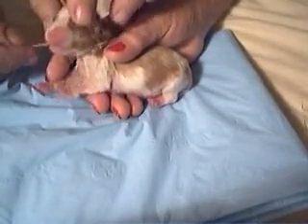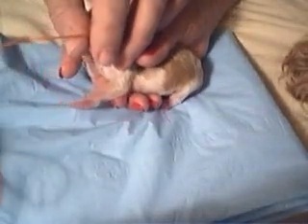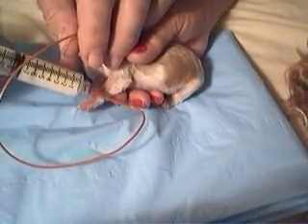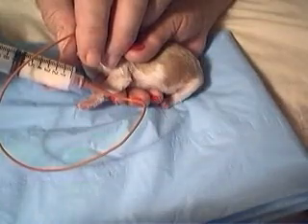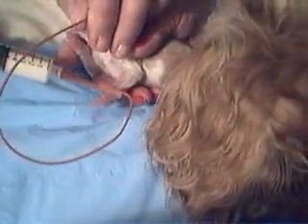Insert the tube. See how he's swallowing? I'll hold it in place with my finger, and I'm giving the syringe the tube feeding. That's 3. That's 4. You watch for anything coming back out through the nose, which of course it isn't.